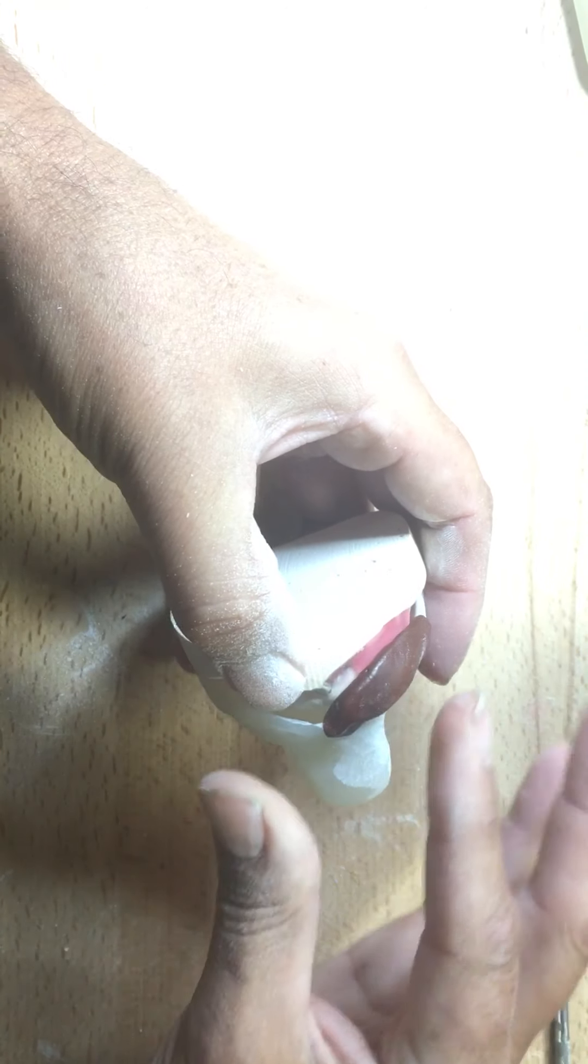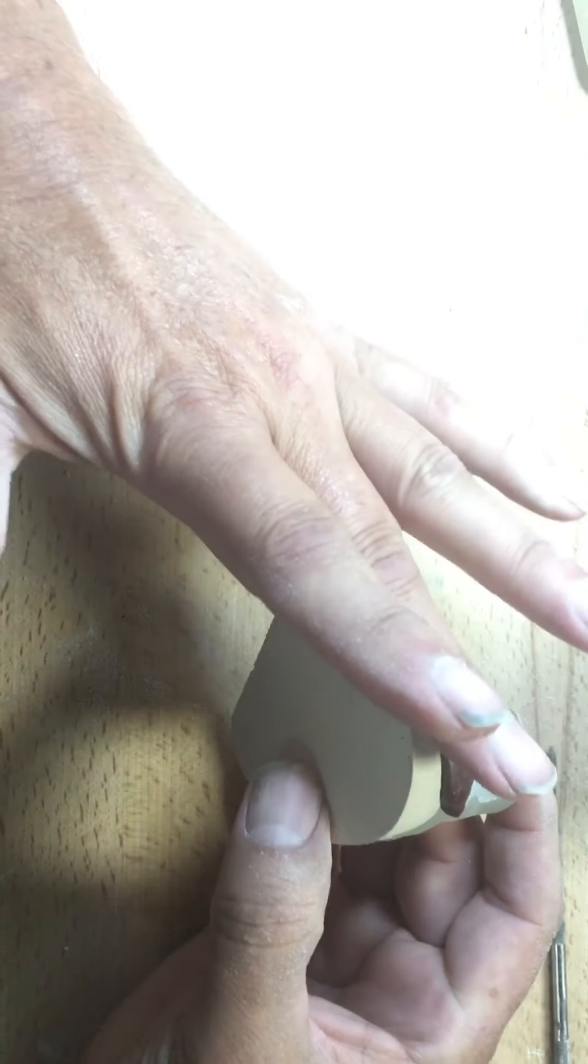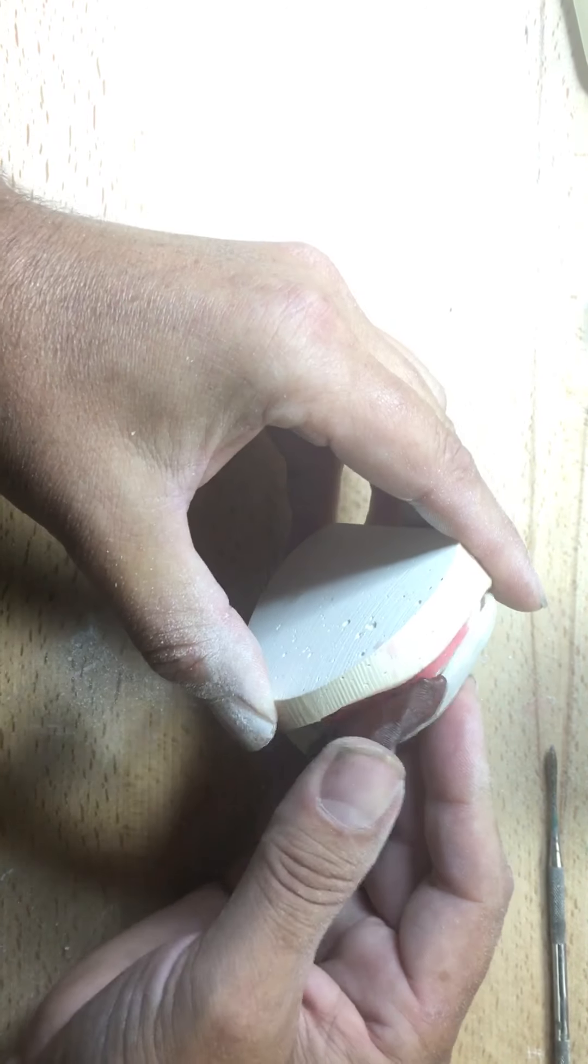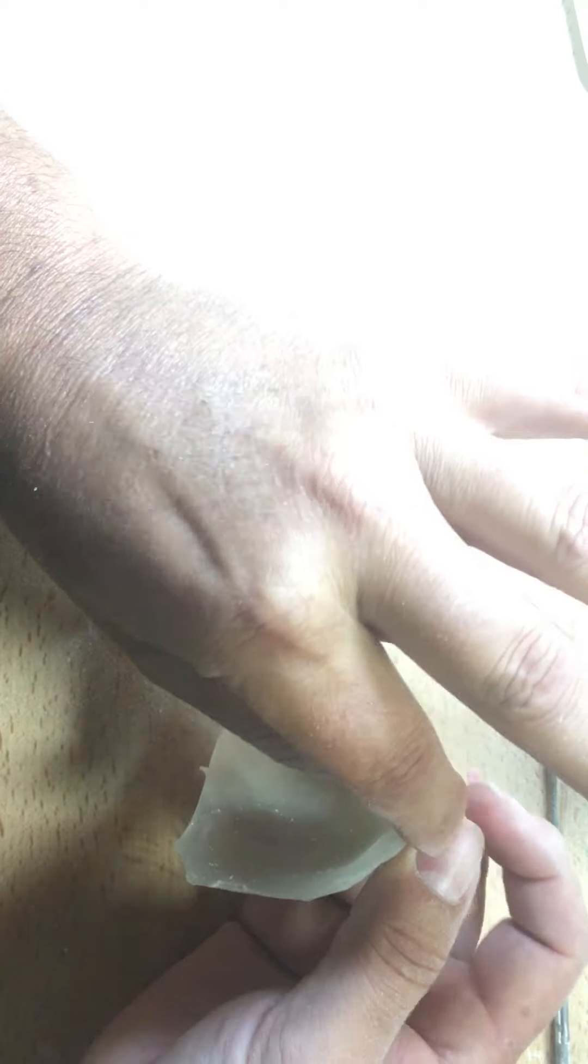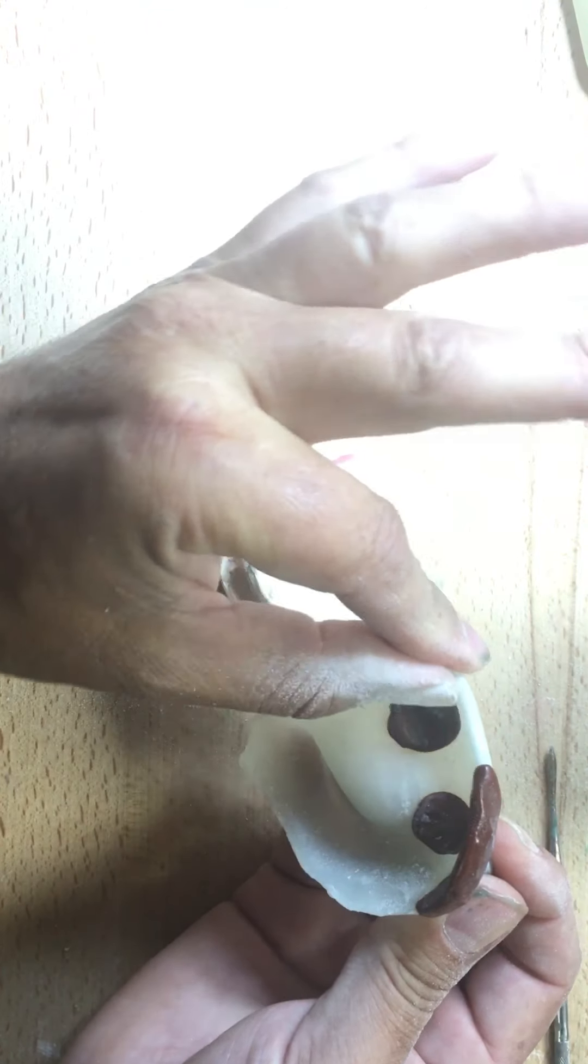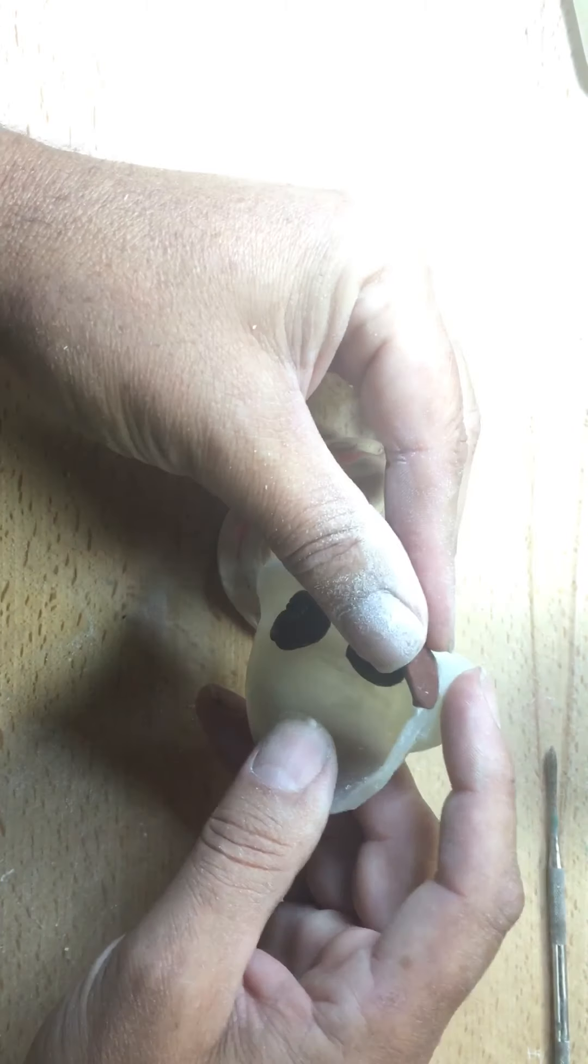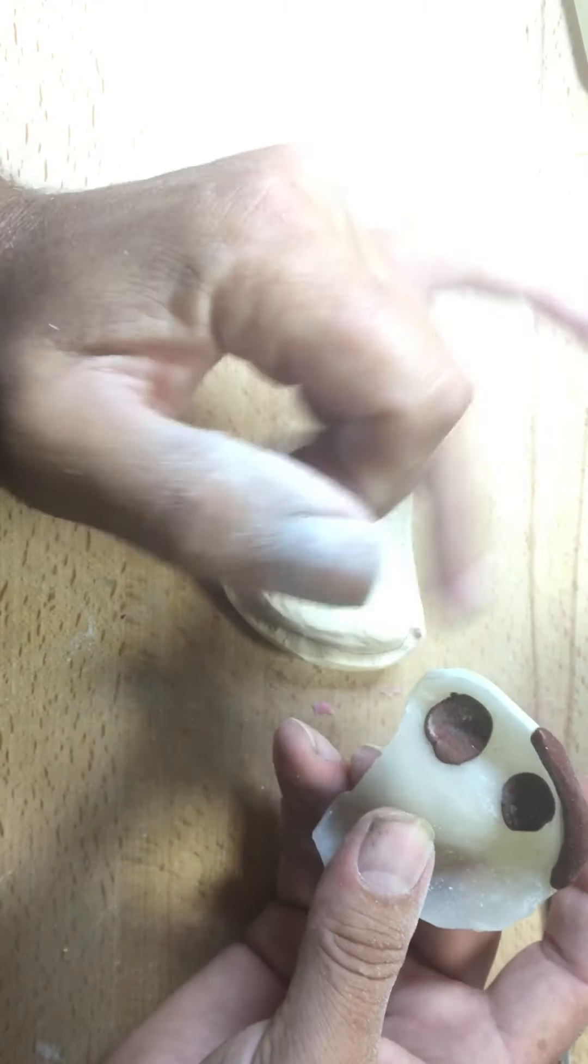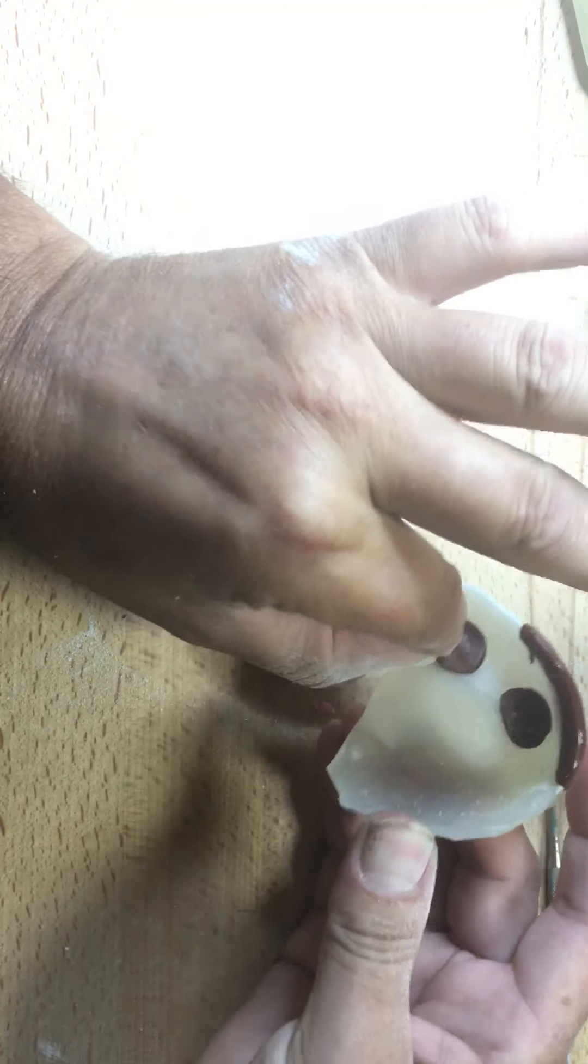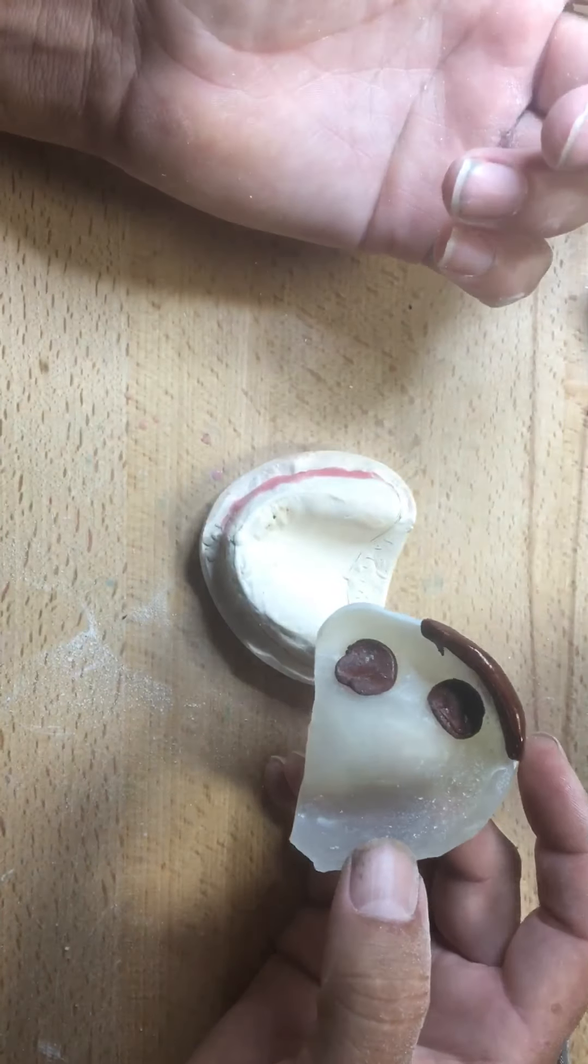I'm going to take the compound and lay it across the quadrant. I'll do the anterior quadrant first, or the posterior first, if I chose, depending on which technique you're most comfortable with. Again, it has to be in the patient's mouth in the same position. So I have my stops. I go here, and I'd go through my border molding exercise. I would take their lip, extend the frenums down, roll the tissues down on the buccal side to create that, not just the length of the extremities, but the width. So I would even get the mandible to go a little left and right. This will thin out over here around the tuberosity that will just not only give me the length of the denture base, but will give me the width of the denture base to maximize here, especially in this area where the buccinator muscle comes in tight. And then I would continue this all the way around, take the stops out, and then put in my final impression material. That would be it.